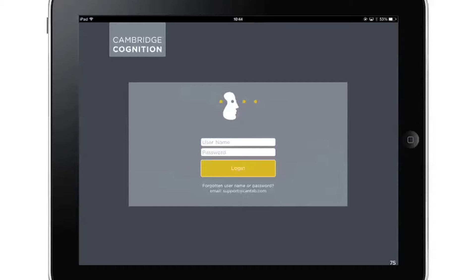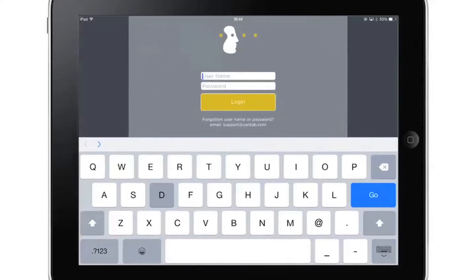This video provides a quick demonstration of the software, which runs on an iPad, to conduct cognitive assessments during clinical trials.